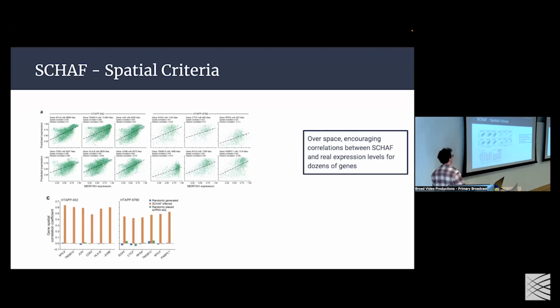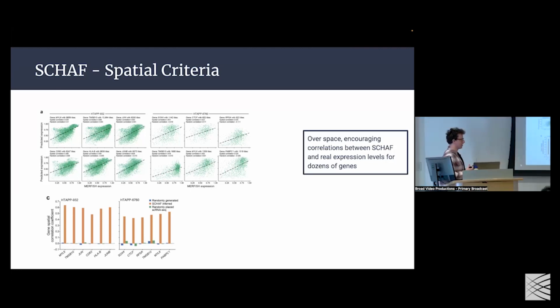First, we look at 6 genes and ask how strong the correlation is over space. What we do is take a tissue and, using this window method, look at different, very small spatial regions of the tissue, roughly 30 pixels by 30 pixels, maybe a couple dozen micrometers by a couple dozen micrometers.